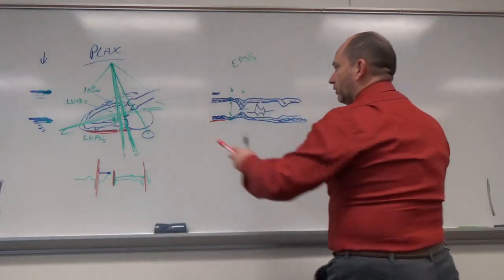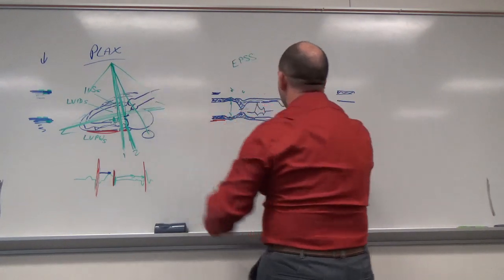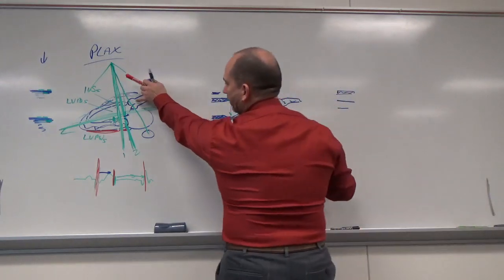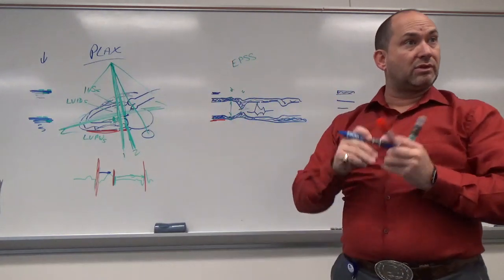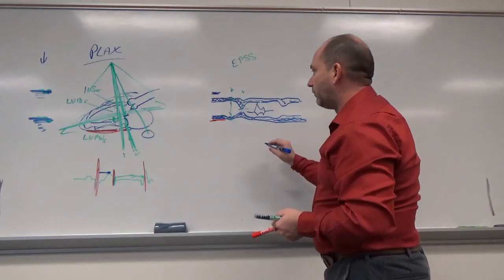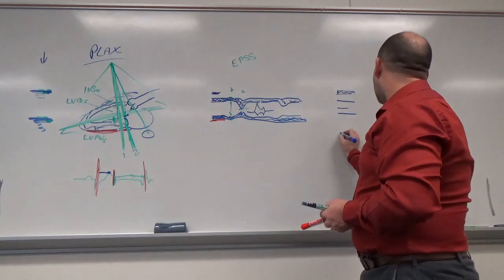What does that look like on M mode? So I've got some right ventricle again. Going to go through there. The next interface is just a thin line, not like this thick muscular line here. Then the next one is another line, which represents what? That's my valve, the aortic valve tips. It's got both the right coronary cusp and the non-coronary cusp together right here. They're going to separate when it opens. We're going to see a box form with that. The next line is the back side of the aortic root. And then the next line is the back of the left atrial wall.